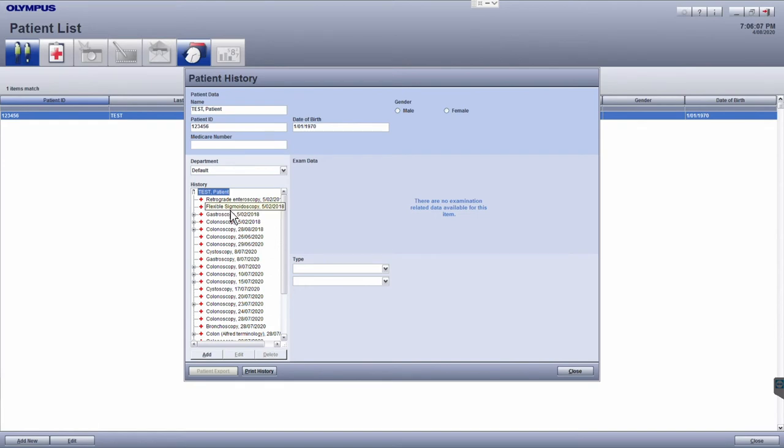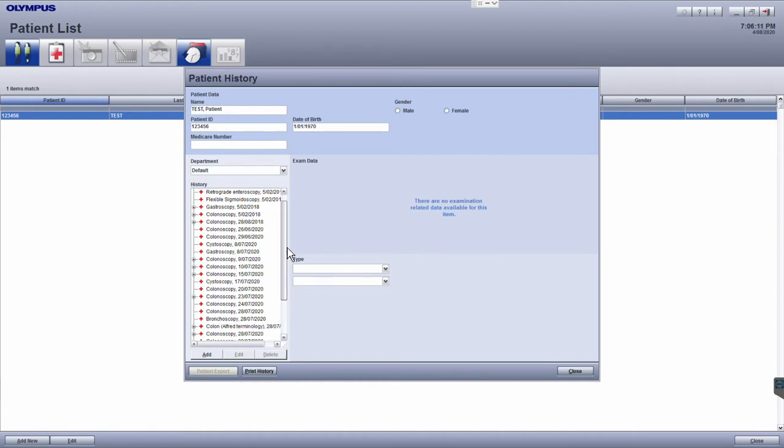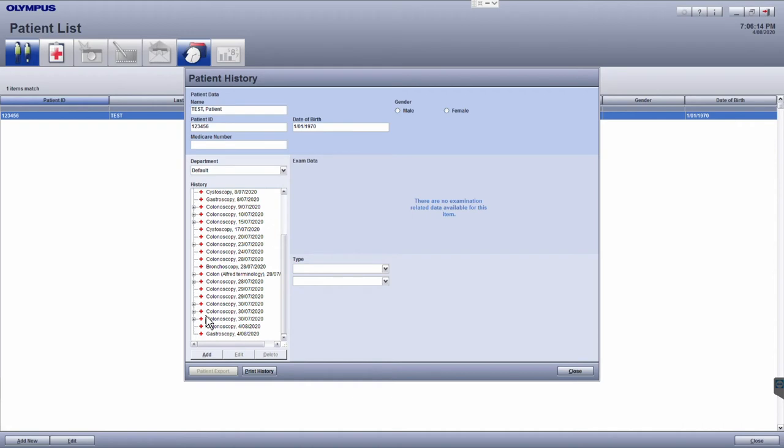From the history list, click on the examination you wish to view to get further details. You can expand or collapse the list to show all examinations, images, videos, and reports for the patient.